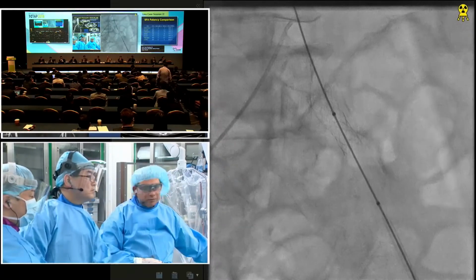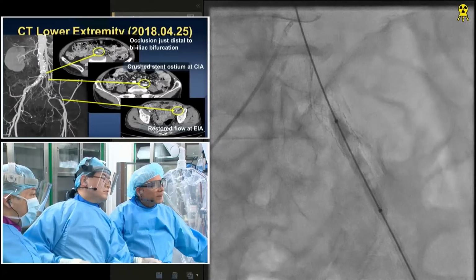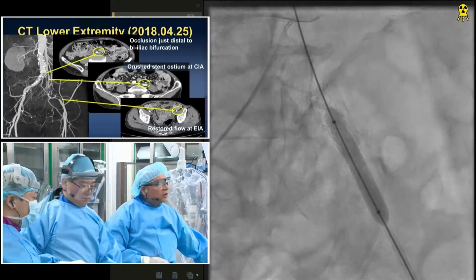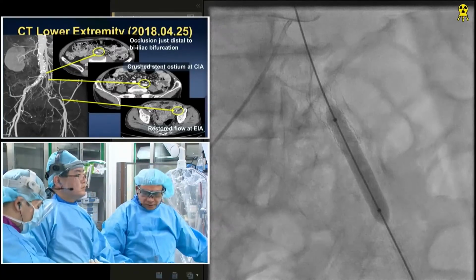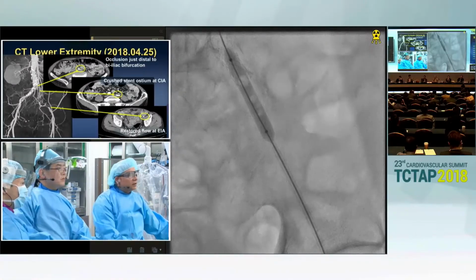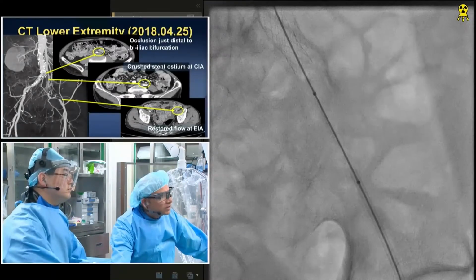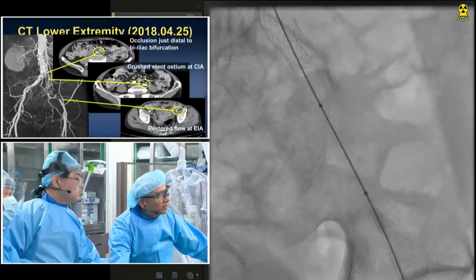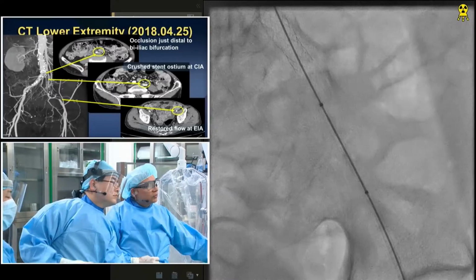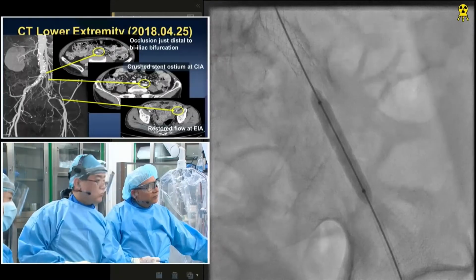When you make the retrograde approach at the proximal end of a stent, the wire sometimes rides in the subintimal space, so we are careful about the proximal cap. The other thing we are noticing while we are doing this is that we are ensuring the balloon is not deforming the stent while we're inflating it, confirming what the IVUS has said, and the RAO and LAO confirmed earlier, that the wire is in the central lumen of the stent rather than through the struts.